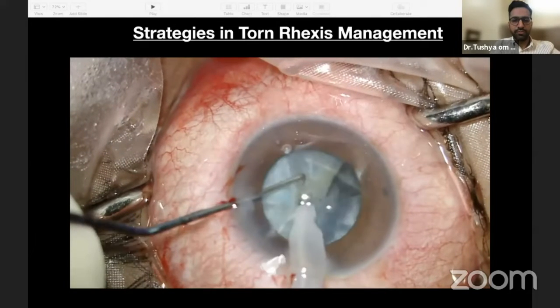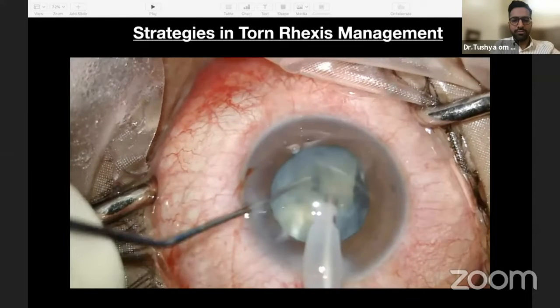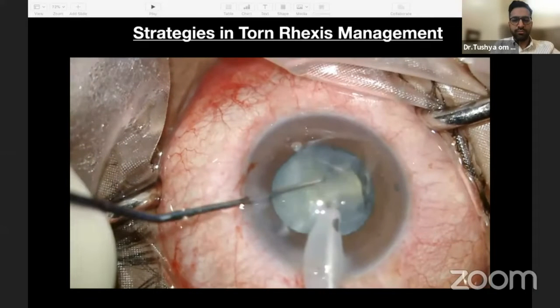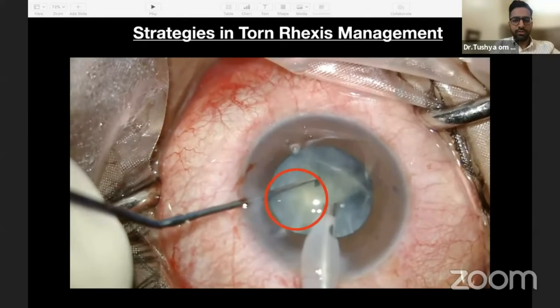There were minimal separational forces applied again. I also avoided sudden collapse or deepening of the chamber. My phaco parameters were on the lower side. Flap was still everted and fluttered.